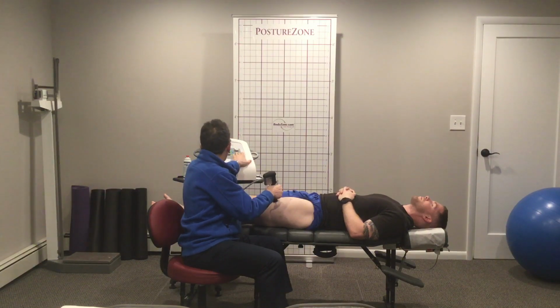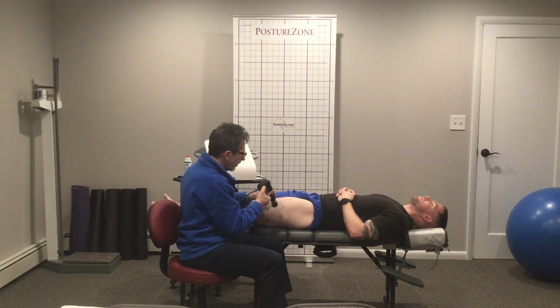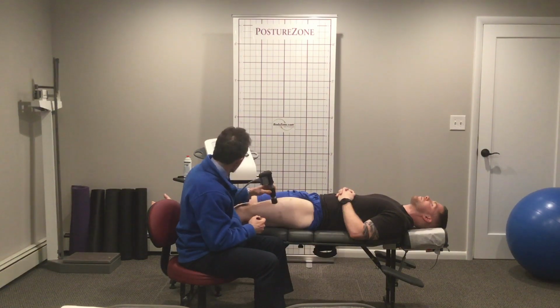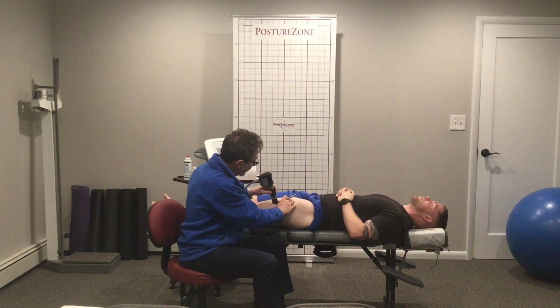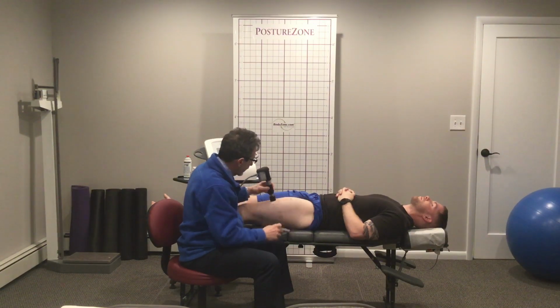So let's bring this up. I'm using my Chattanooga Mobile 2 unit today. So, high frequency, 20 hertz, not too much penetration, but I can feel it right there where the lesion is. So I'm not going to go on the lesion.